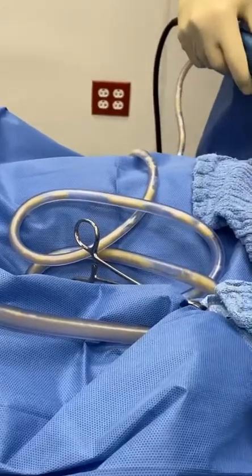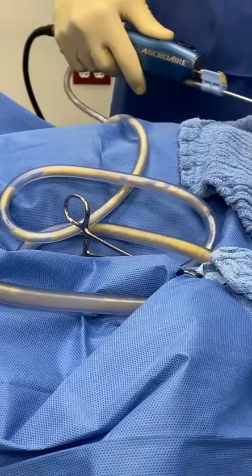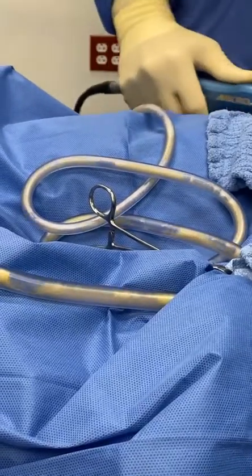Wow, look at that! That's a river of very beautiful yellow fat without not even a speck of blood. This is just incredible.